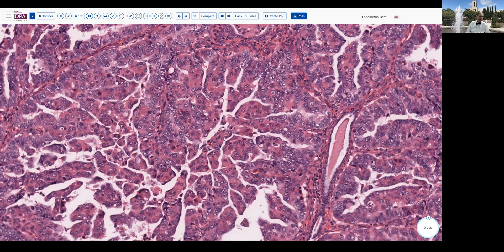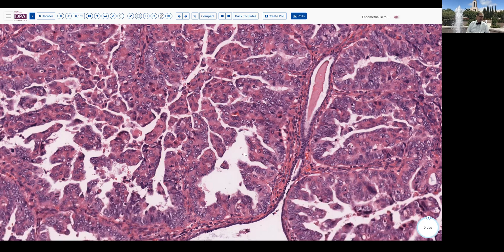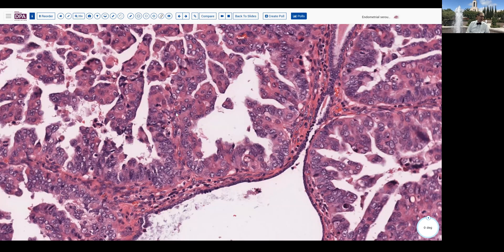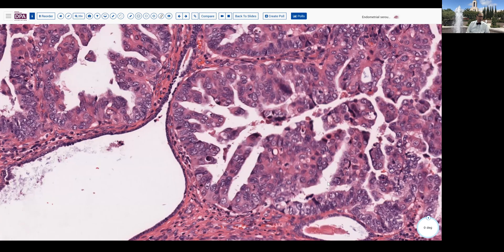Here we see an entrapped benign gland adjacent to this tumor. As we look at this, we notice that there is a high degree of nuclear atypia — there are macronucleoli, overlapping nuclei, mitoses, and karyorrhexis. So this is a high-grade carcinoma in terms of nuclear atypia. Here's some mitotic activity, and again a benign gland for comparison.